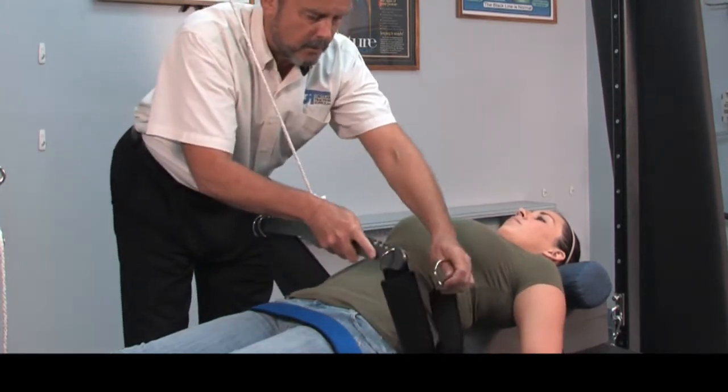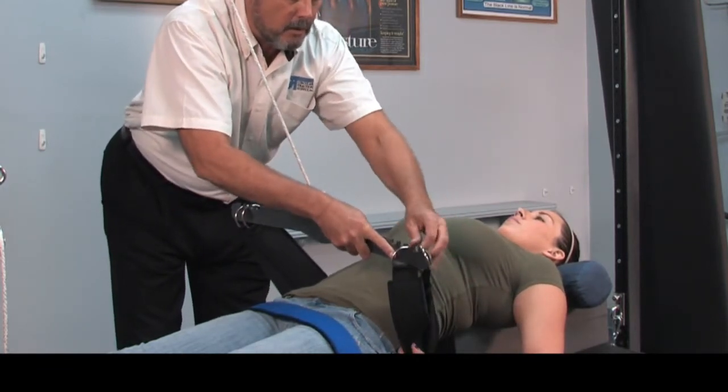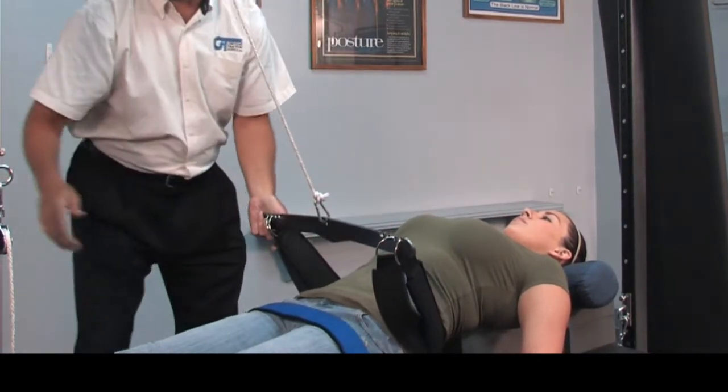As soon as we have both of those hooked up to our crossbar, we can now start to apply our traction.